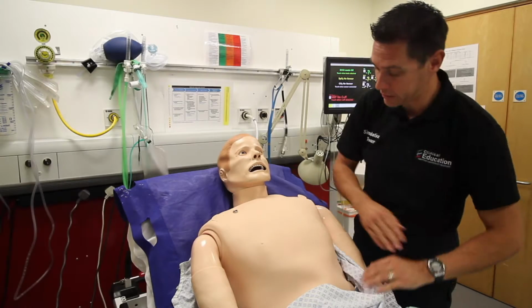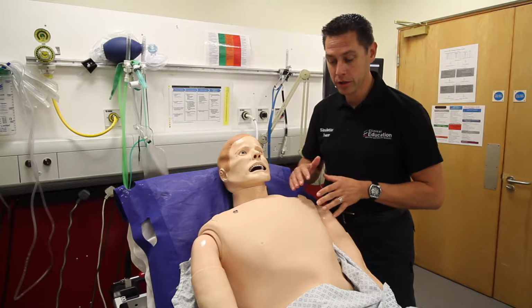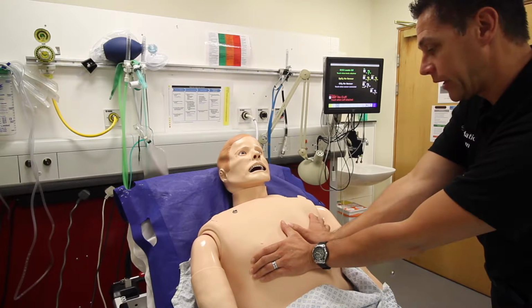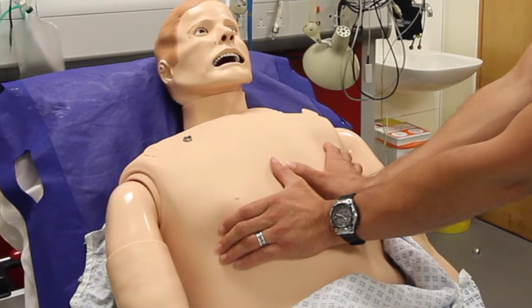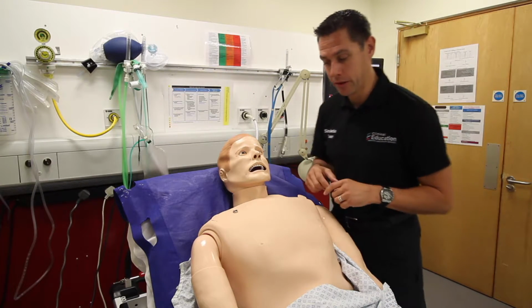You can see that his chest does move up and down. It can be sometimes a little bit tricky to see, so my general advice is if you are looking at his chest and you want to see how well it's expanding, you can put your hands on his chest like you would do in a normal patient. So if you put your hands on his chest here, you can see my hands start to move up and down. The chest movement can be equal, it can be unequal, but it can sometimes be difficult to see, so it's worth having a look at.